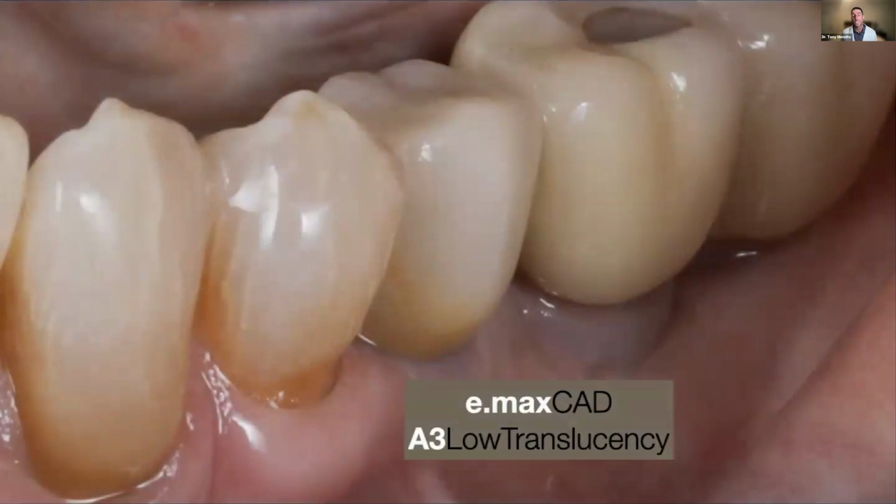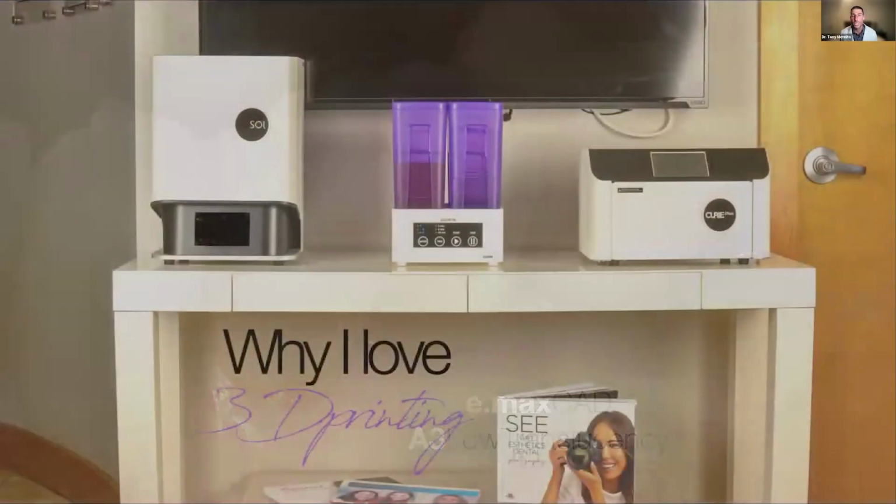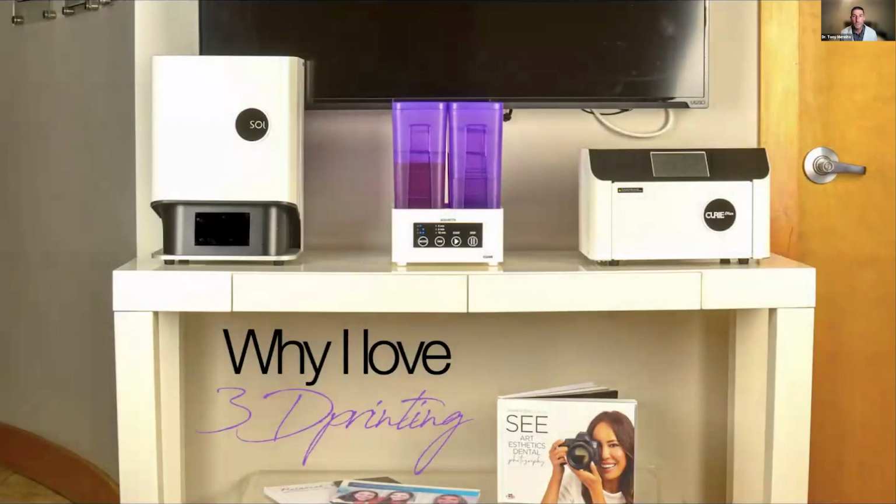And once again, my patients love it because by the time they get to the point where the implant's ready to be restored, they've already had a really long path with that tooth, right? They've waited for months, and they don't want to wait another month and a half to get their crown once they're ready and come in for their final impression. So I really love that we're able to do this as well for our patients. So that's why I love milling.